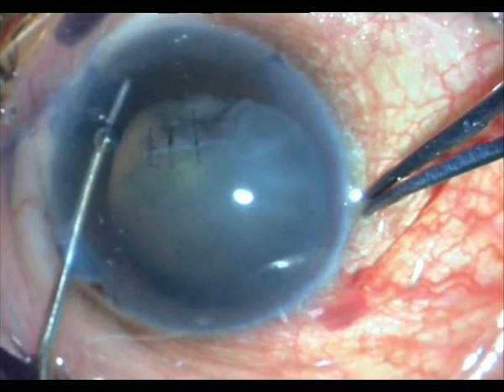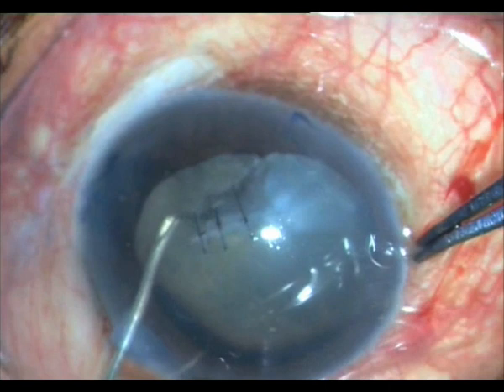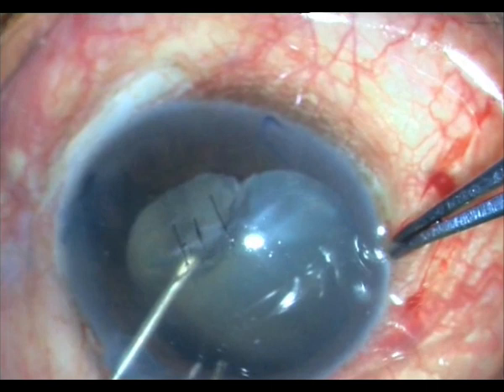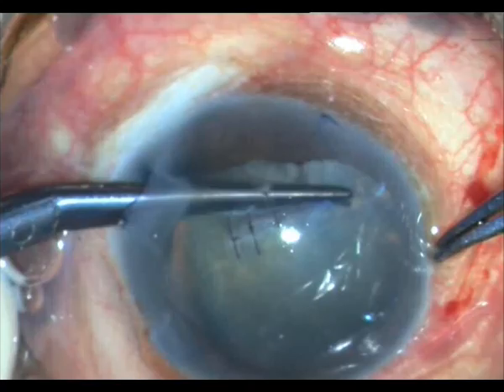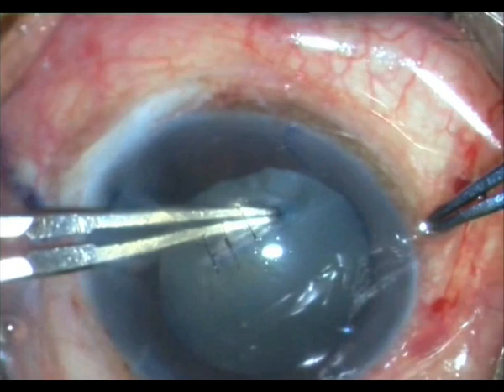From the tear edge I am trying to pull it down to make a rhexis, but it is not working — it is so hard. So instead, I go with the angled Wanas and make a nick at the lower end of that tear. Then from that, I use my Utrata forceps and fashion a crude rhexis.